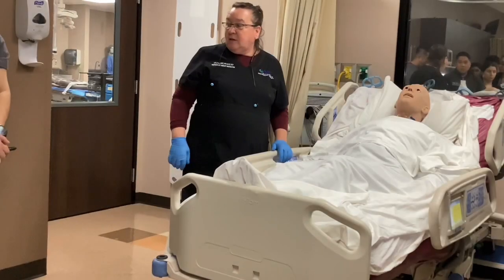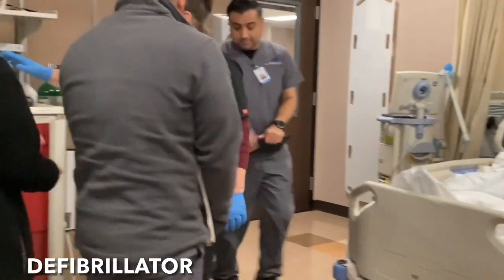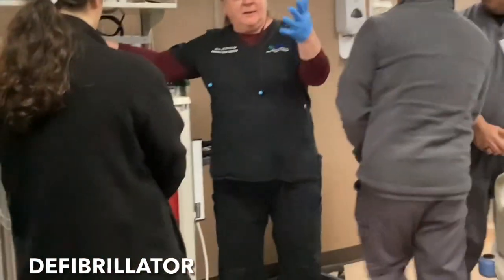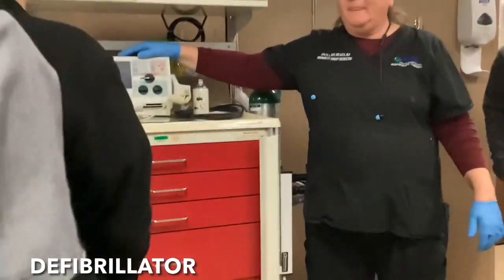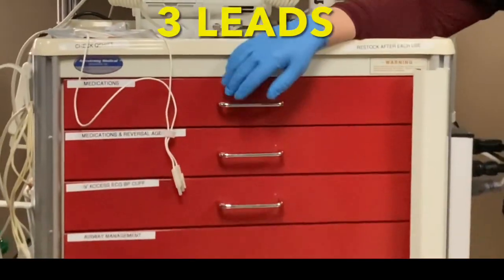Show you guys on the crash cart. So this is our defibrillator. Make sure everybody can see. So this is our defibrillator, and these are the 3 leads we were talking about going on the patient.